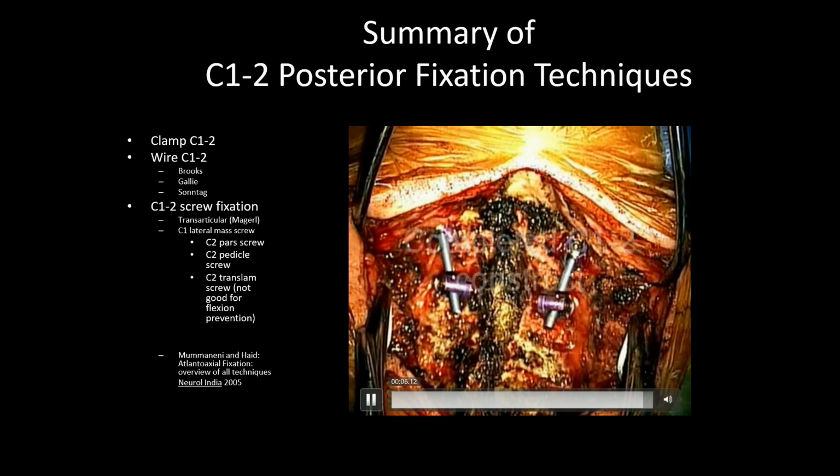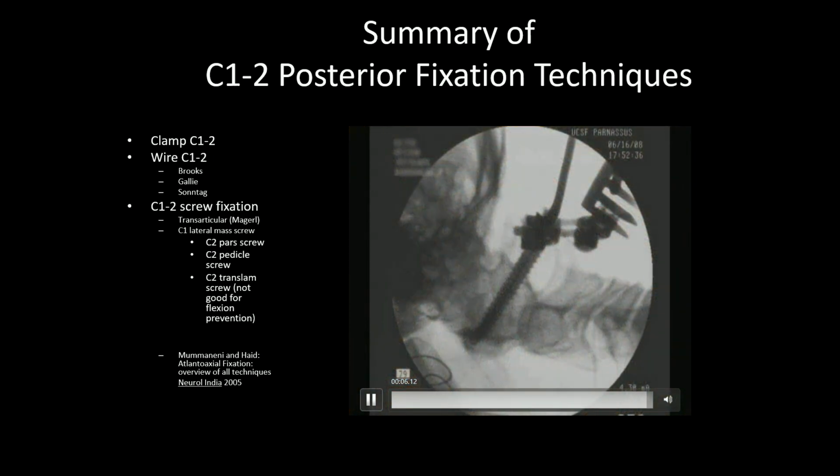And then the next question is where you can put your bone graft here, which you've got to put in the middle because you didn't take the nerve root in this case, or I didn't take it.